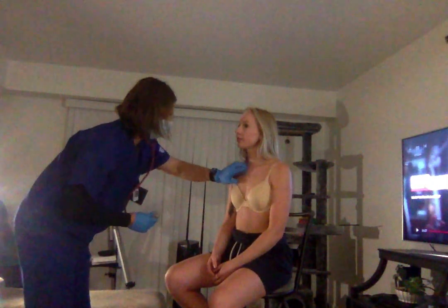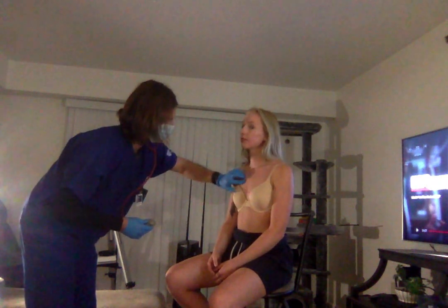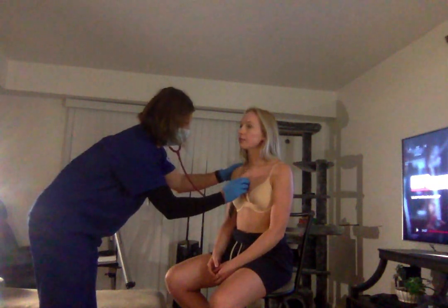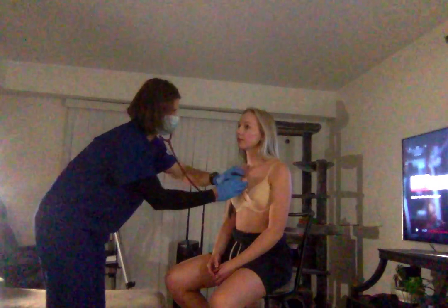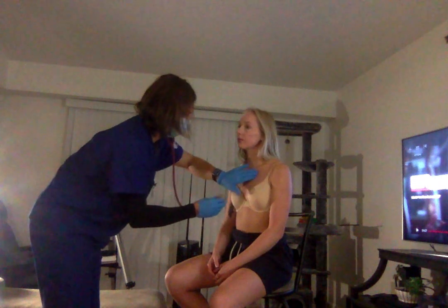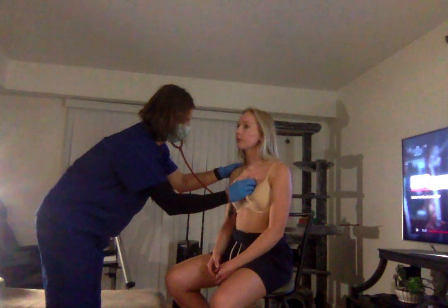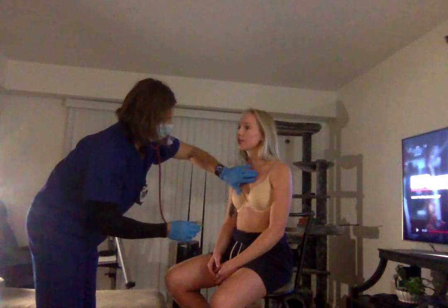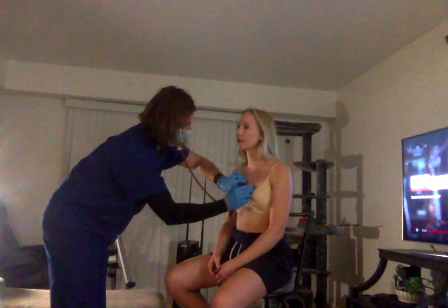Alright, I'm going to start with the aortic. So I'm going to go 2 intercostal spaces down, and then I'm going to go right to sternal border. And then I'm going to go to the pulmonic, which is 2nd intercostal space, left to sternal border. And I'm going to go 3 intercostal spaces down for Erb's point, and that will be left of sternal border.